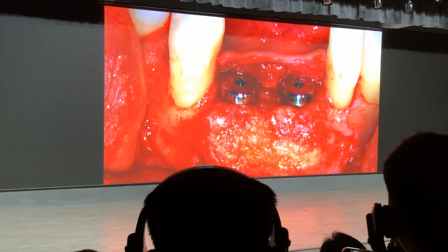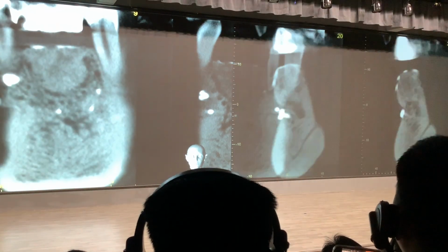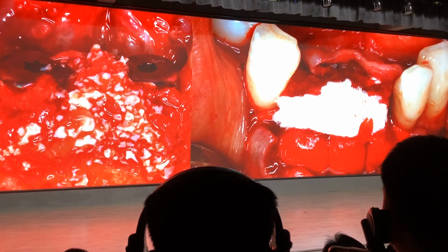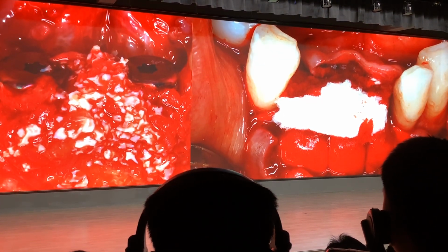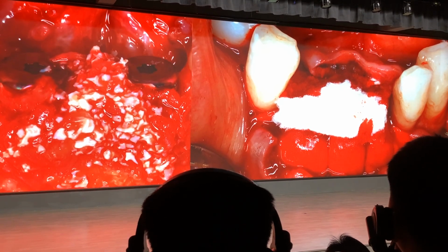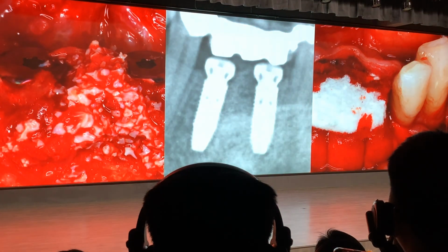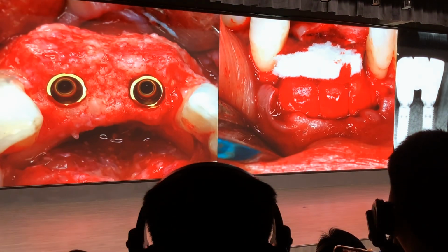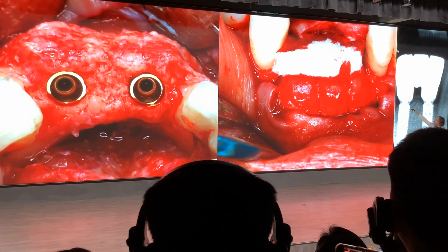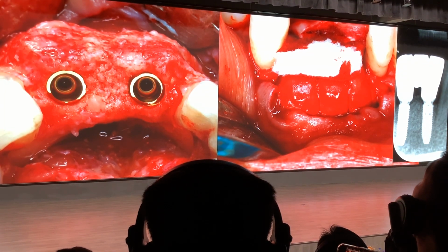Then I can do mini sausage in here. That's how this is going to mature. And you can do a mini sausage, collagen membrane, collagen matrix. This is like a piece of fiber guide for thickening. And look at that, the bone is into perfection for this.